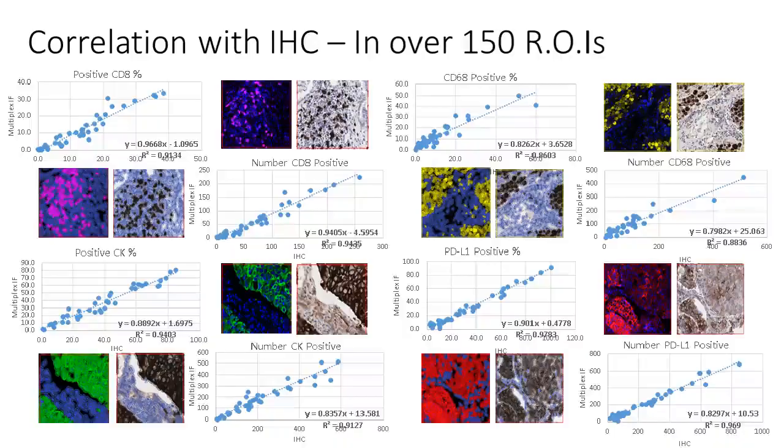So when we compared the data extracted from the DAB IHC images and the single IF channels, we found a fantastic correlation between all the different channels. So we were highly confident in the comparability between the different methodologies, and you can see the R-squared values there. So we were very, very confident taking this forward that the multiplex immunofluorescence would give us a comparable assessment to DAB IHC.